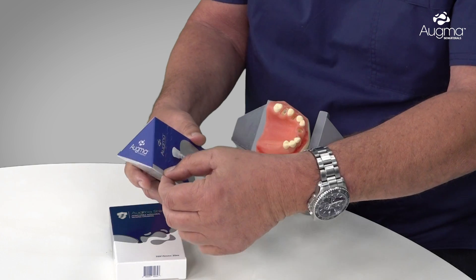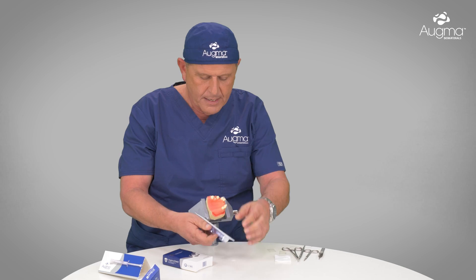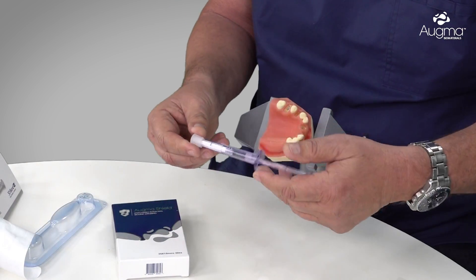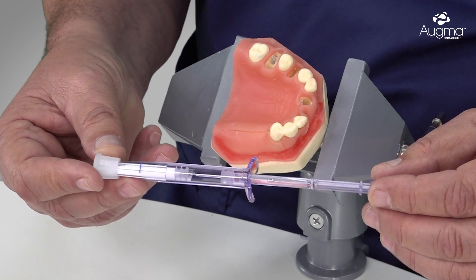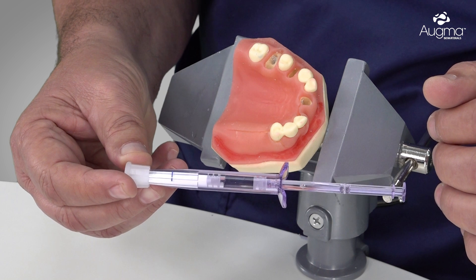When we have a missing buccal plate, we reflect a minimal flap as shown in our protocols. First, I need to open the box of the 3D Bond Plus. After extraction and complete debridement, that's the time to prepare the 3D Bond Plus. As you can see, it is a smart syringe that contains a shaft, two pistons, a cap, the powder, and a saline solution.